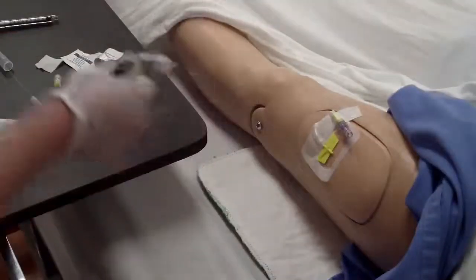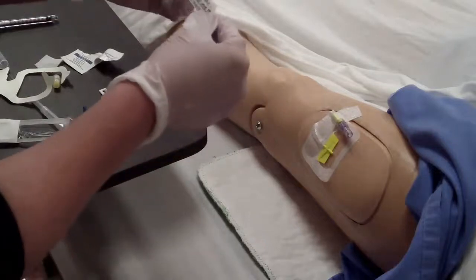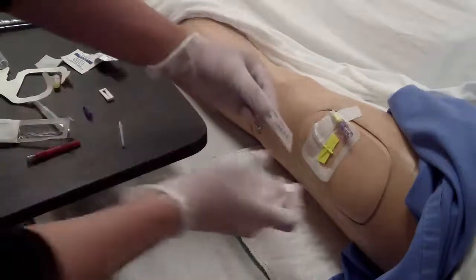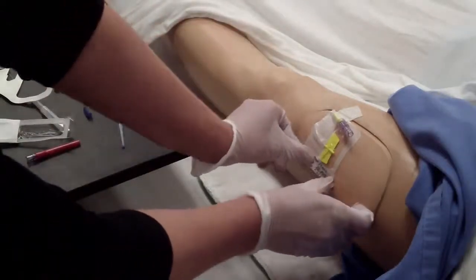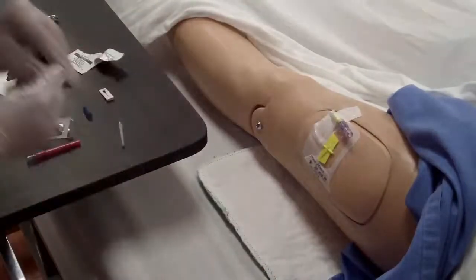On the other piece of tape provided on the dressing, write down the medication, the concentration, and the date of insertion and apply this to the side of the dressing. You can now tidy up, discard any sharps appropriately, and ensure that your client is safe and comfortable. You will also need to document.